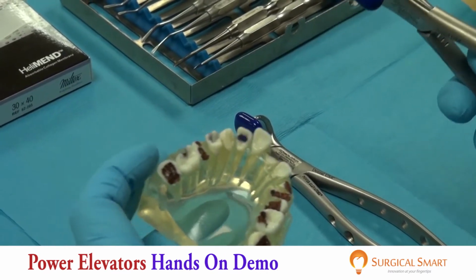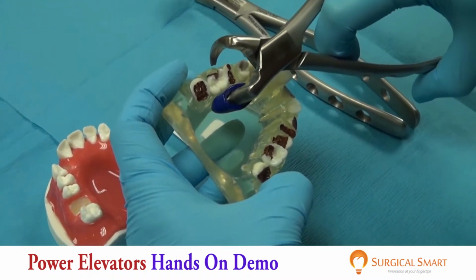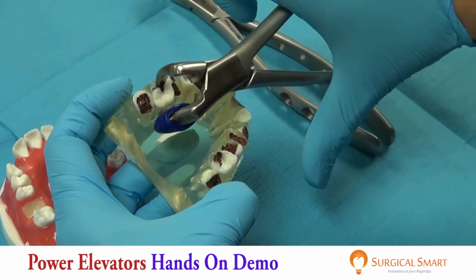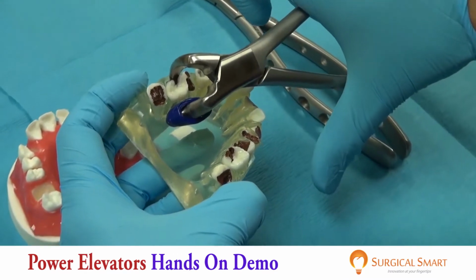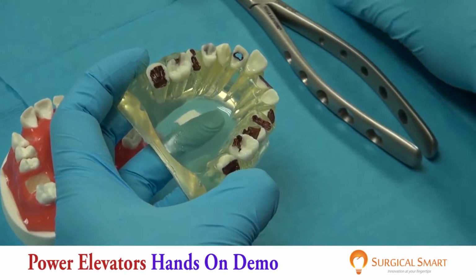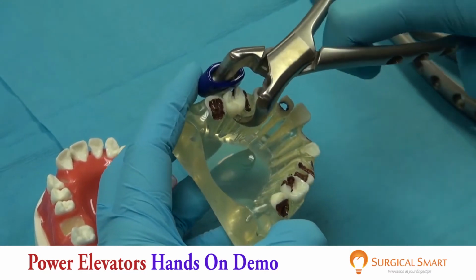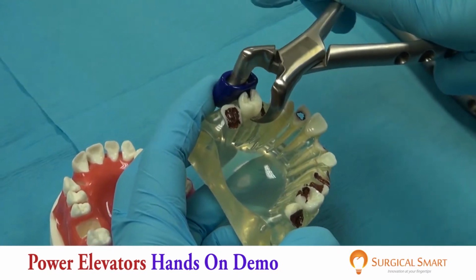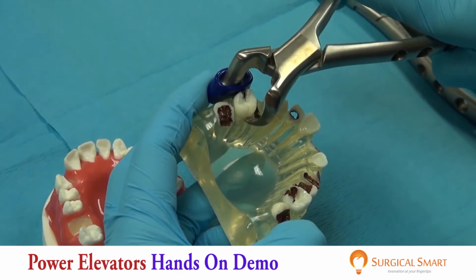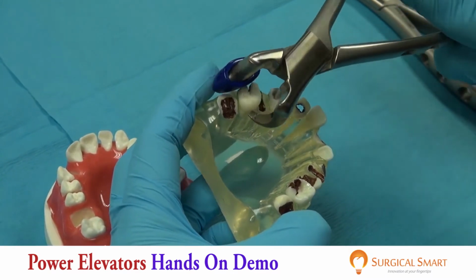And so for example, if I wanted to extract this upper molar, I would put this pad over the tooth and I would then rock it toward the palatal. And you see how the pad acts like a fulcrum, and I can perform that extraction. You rock it toward the palate, and then after that you put it down. You take the other pad and then you rock it toward the buccal, and you just lift it up. And so as you can see, this is basically a class 1 lever, and a class 1 lever uses the benefit of a fulcrum, which then magnifies the force of the leverage.